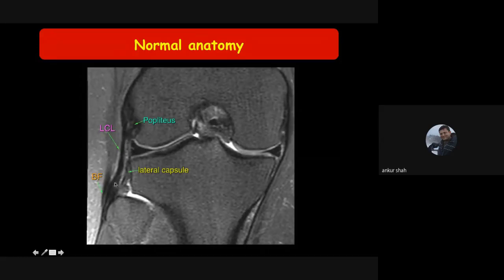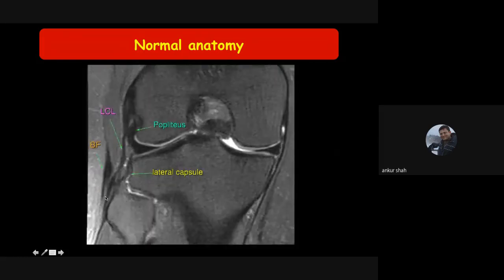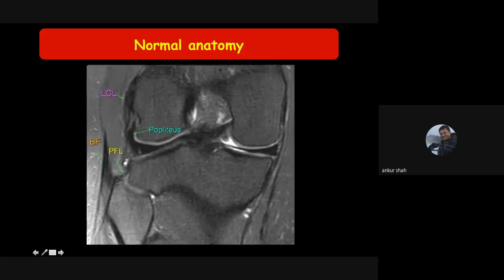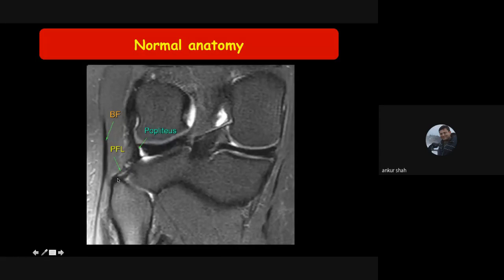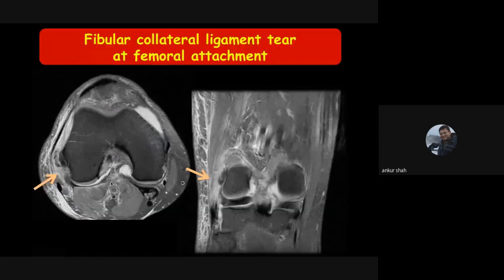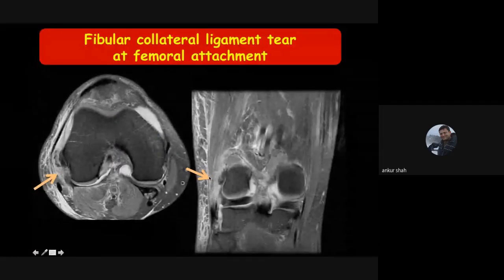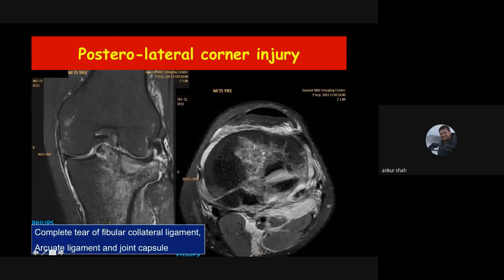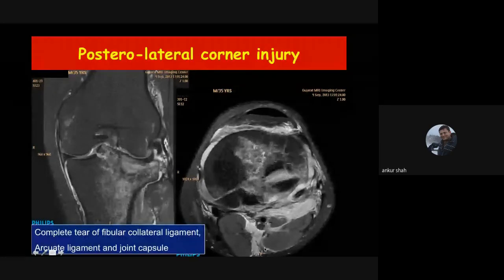On MRI, the lateral collateral ligament and the biceps femoris tendon merge together and attach at the lateral aspect of the fibula. The popliteus tendon and the popliteofibular ligament (connecting the tip of the fibula with the popliteus tendon) together form the posterolateral corner. Avulsion at the fibular collateral ligament femoral attachment indicates a PLC injury. In severe cases, there are multiple injuries including fibular collateral ligament tear, arcuate ligament and capsular injury, and extravasation of fluid outside the joint into the intermuscular region.